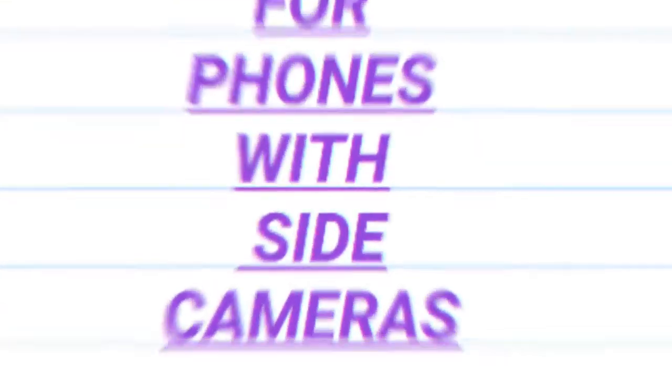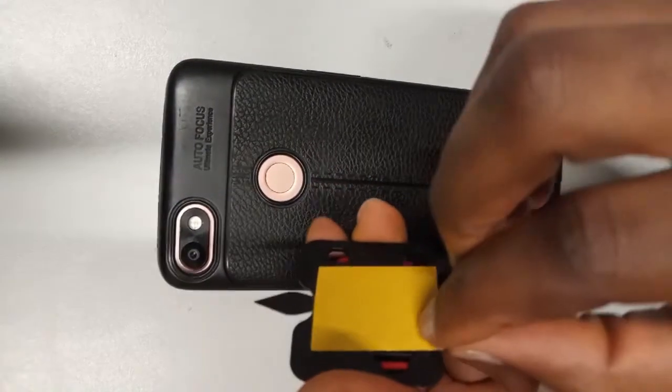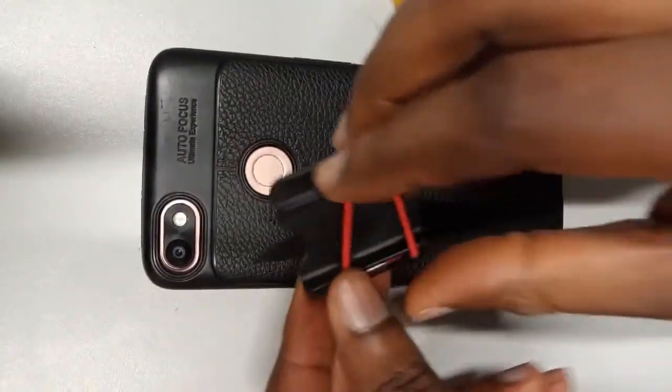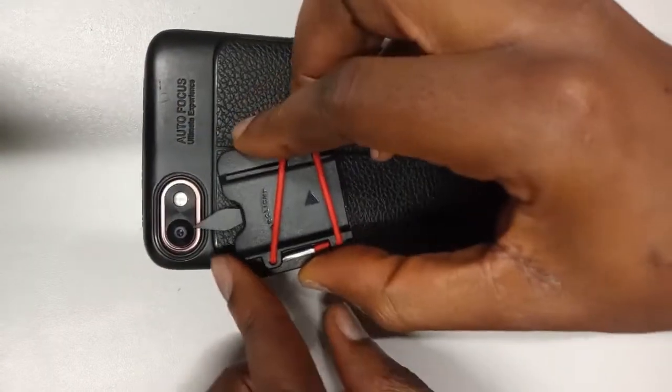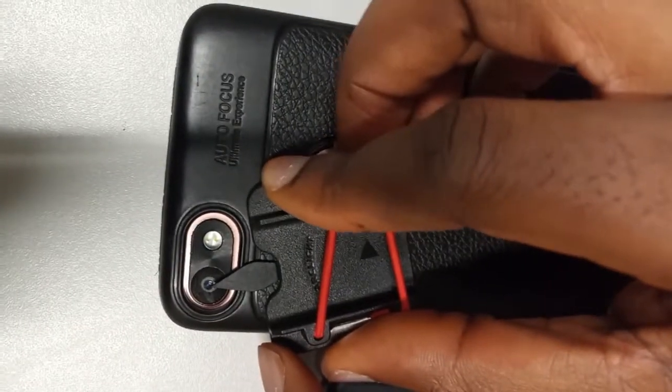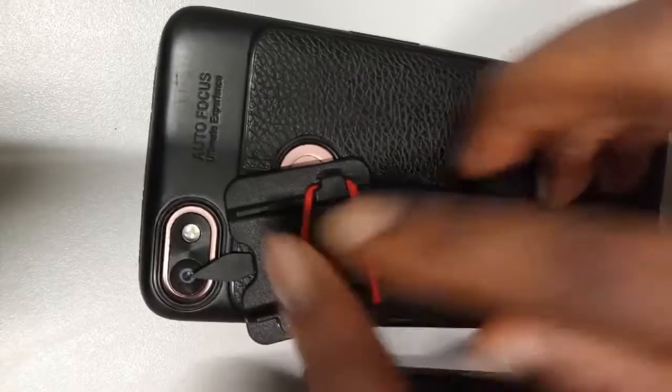For phones with side cameras, you peel this part off and then place it diagonally at the center of your camera, like this, and you click.